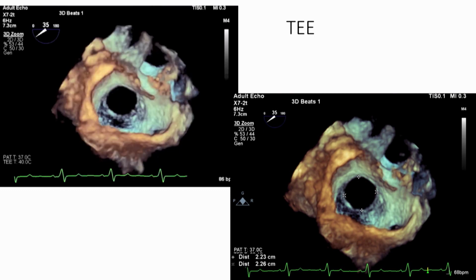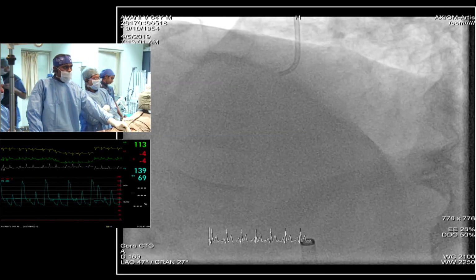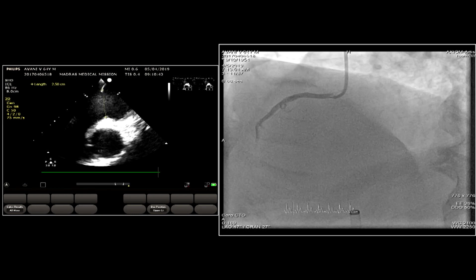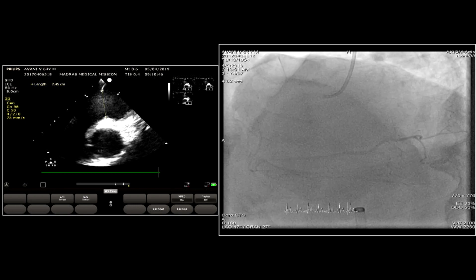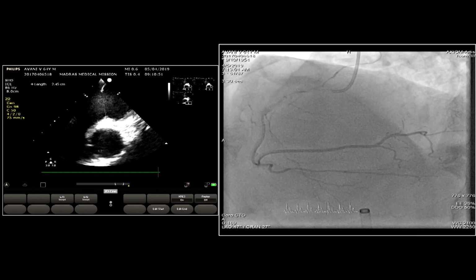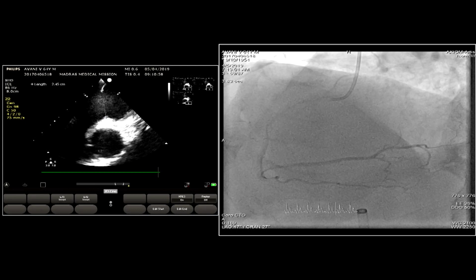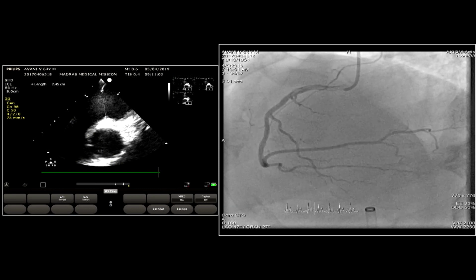Srija, can you measure? Now we are live on intracardiac. Can you switch over to echocardiography? Do you plan to go with this size, or do you plan to balloon and do the stop flow technique? No, we don't do balloon sizing. Right now, can you see the intracardiac echo live? What you are seeing on the frame is the intracardiac echo, and now the measurement is something like 24, 25.